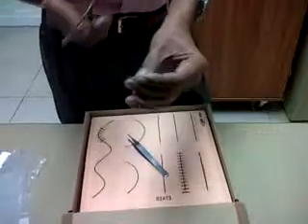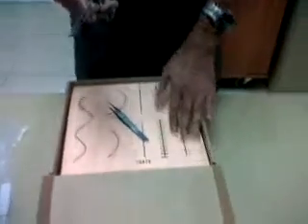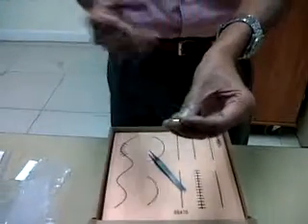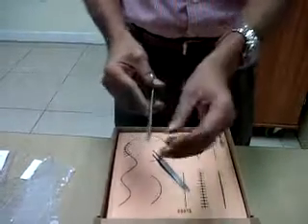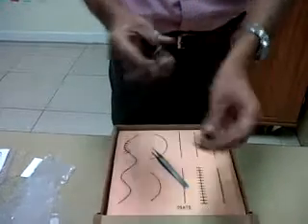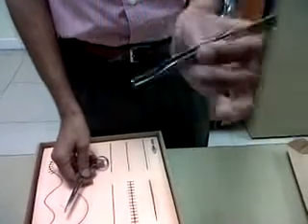Since we are dealing with the skin here, we are going to use a cutting needle. Let's say the patient has come in with an injury. First we use the needle holder and hold it — the junction between two clicks is usually sufficient. If the needle still rotates, we can make a third click.